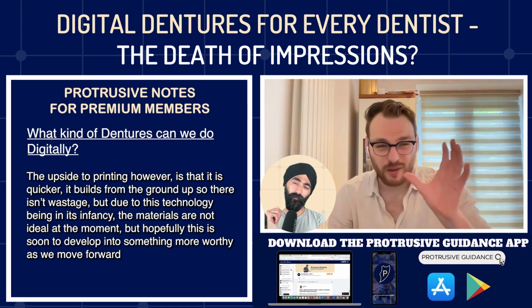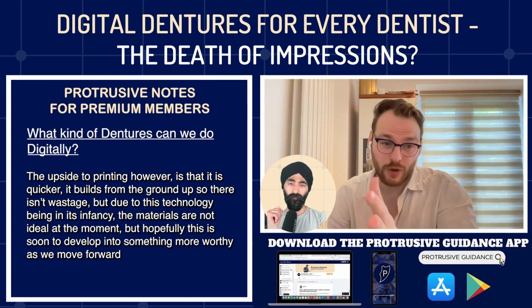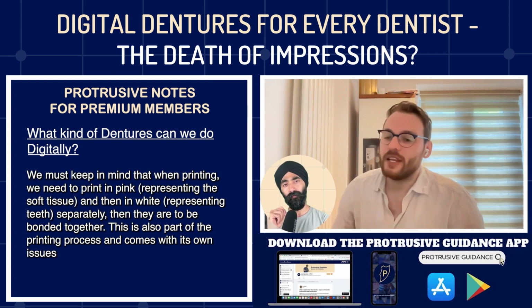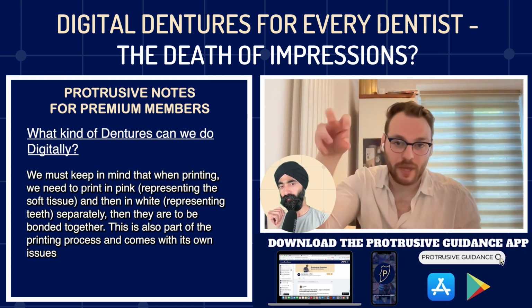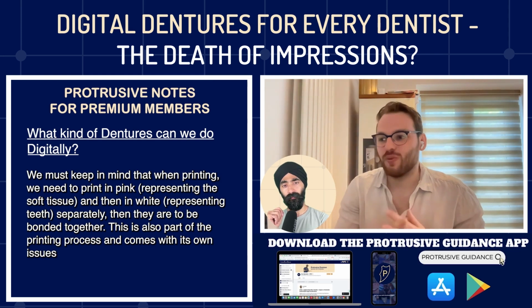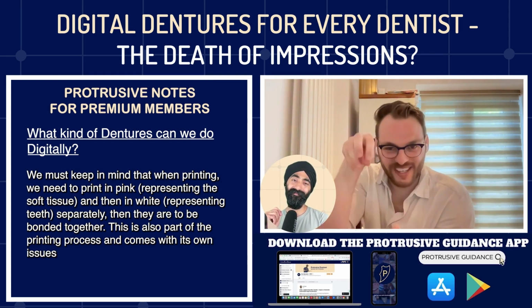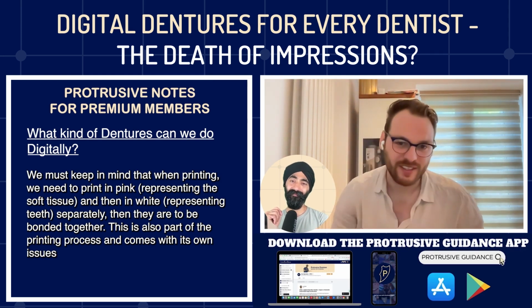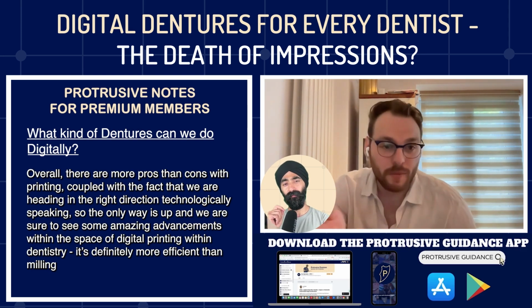In general, with this, complete dentures is the easiest way to get into the digital, beyond what you said with immediates, and again, I'm sure we'll get to that in a bit. But essentially, the printing process there again is in two stages. It prints the pink, it prints the white, and you bond them together. And that's where the partials is quite difficult. If you've got like the single tooth, how do you know you bonded it exactly right? Whereas the completes, when it's like a horseshoe of teeth, it's a lot easier to get that into the correct place. But printing's going to be the future.